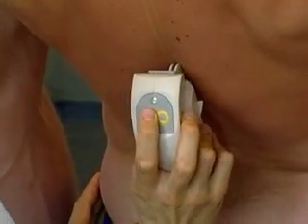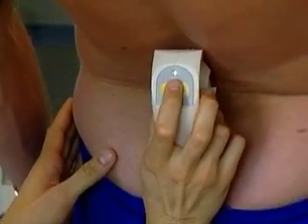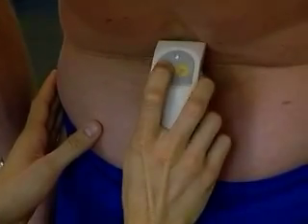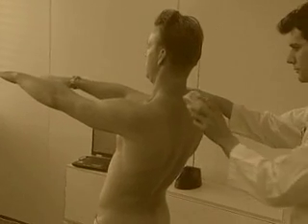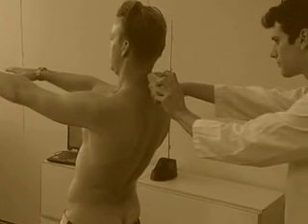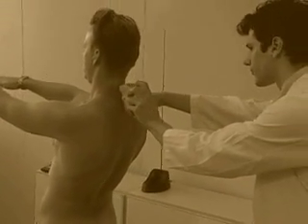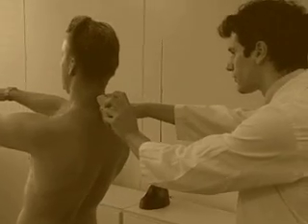The device is very useful in the assessment of posture and mobility. Moreover, it's perfectly suited for the objective quality control of the follow-up to therapy.